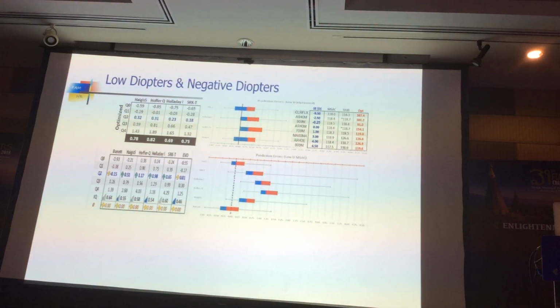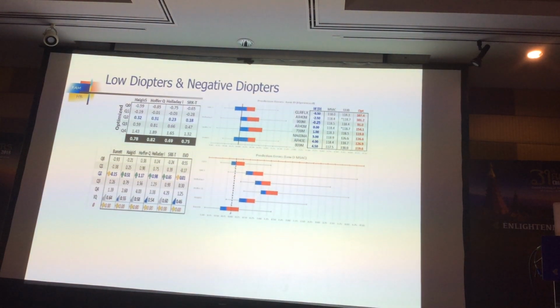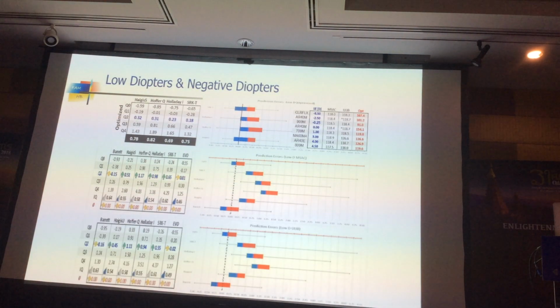So you can't use this formula anymore unless you personally readjust it and aim for -1 diopter or something like that. There's no RBF here because we are using version 1. This is out of domain for version 1. Because today, RBF is version 2. It is so much more accurate than version 1.